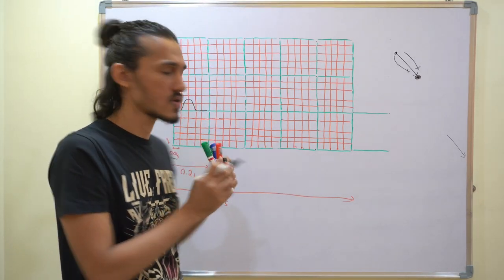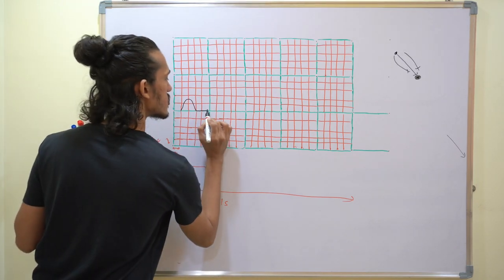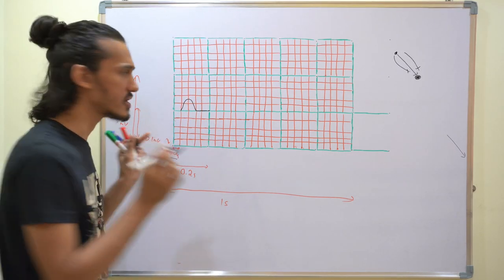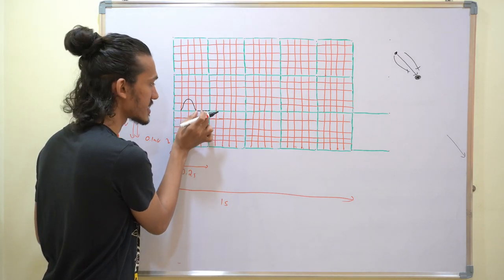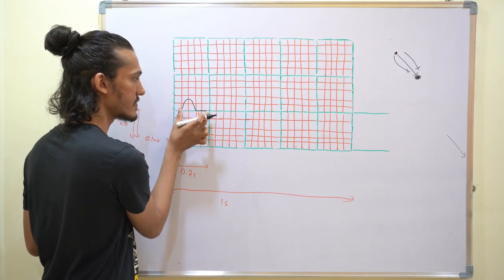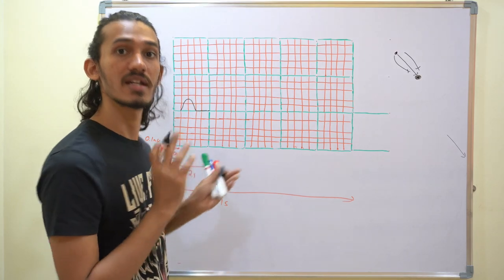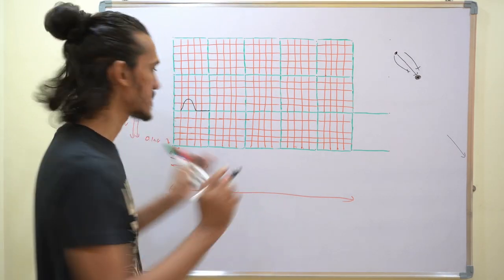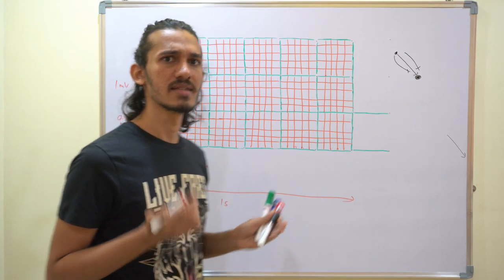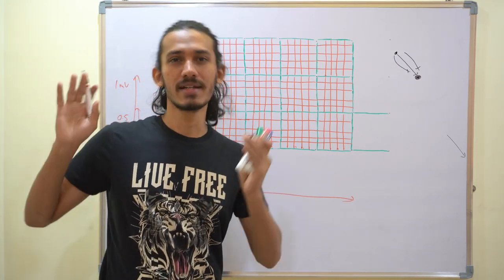So ultimately 2 divisions. Earlier it was 2 to 3 divisions, now 1 to 2 divisions. If you take a look at this whole thing, let's say it ends over here, this is the PQ interval. As I told you earlier, the segment is only the isoelectric line, and the isoelectric line with the wave is the interval. So the P wave with the PQ segment is the PQ interval. You see that it is less than one large box. One large box is 0.2, so the maximum it will go to is 0.2. If it goes beyond that, in this whole PQ interval, it means there's a conduction block. So this normally comes to 0.12 to 0.2 second.